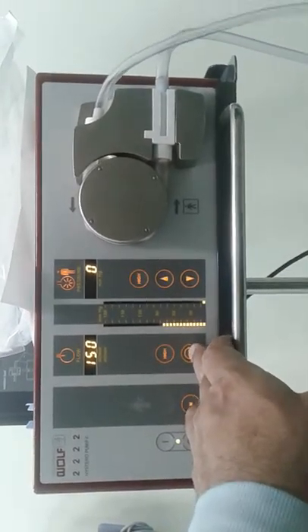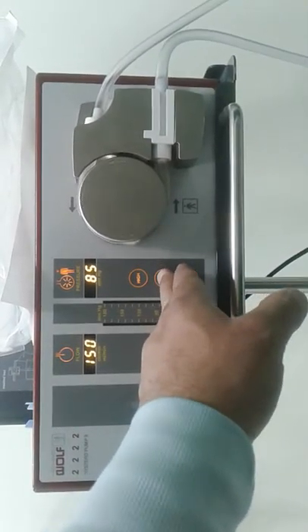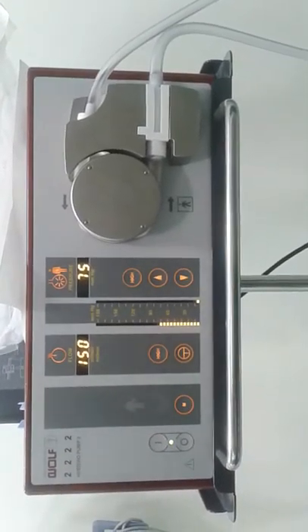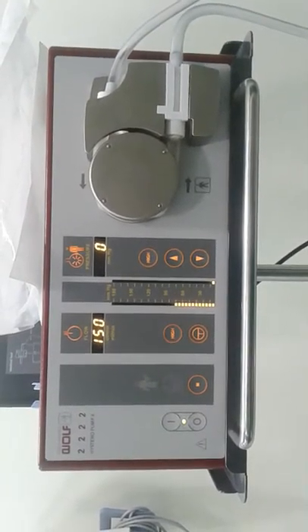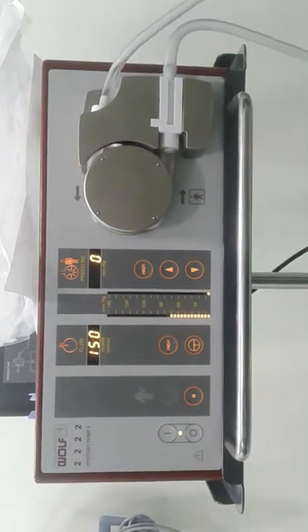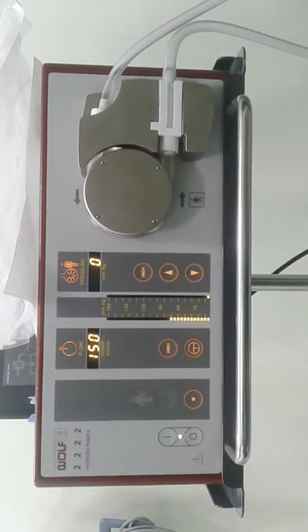While we start this, we can increase the pressure accordingly. The doctor will set what he requires, right? We recommend using the middle level, and if it needs, she can raise it.